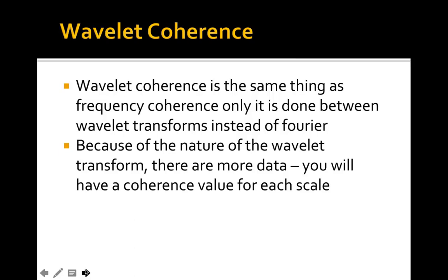Now, with computational power, it is possible to do the needle in a haystack approach and say, I'm going to let only the data determine what is significant in this experiment, in which case you're doing what's referred to as data-driven research. People will often do hypothesis-driven research, which will say, I believe that the right frontal lobe is going to be more active in group A than in group B for whatever reason. There you would confine your analysis to just data that would prove or disprove your hypothesis.